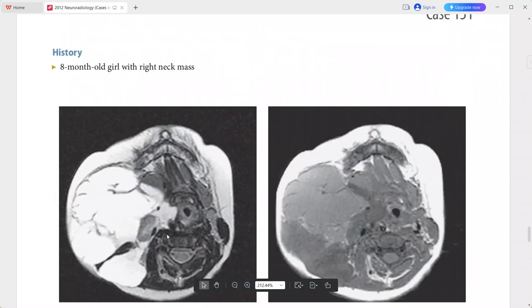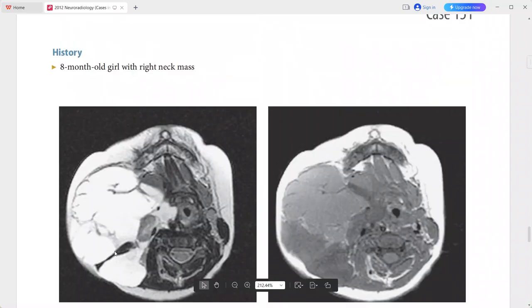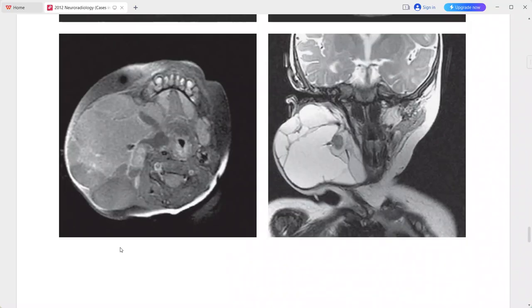There is very little post-contrast enhancement. The mass involves multiple spaces in the neck and is enveloping structures such as the sternocleidomastoid muscle. This is a case of lymphangioma. Differentials include branchial cleft cyst, thyroglossal duct cyst, cystic metastasis, and abscess.